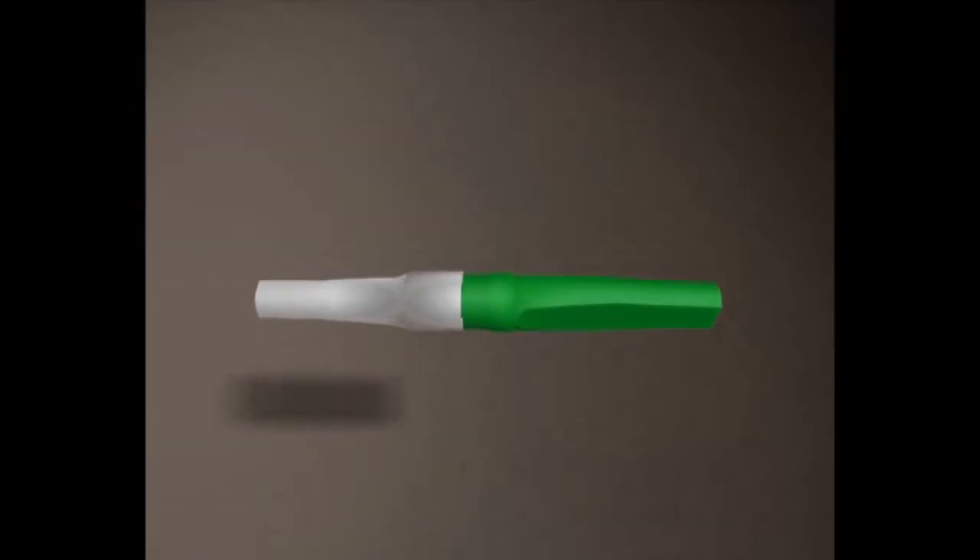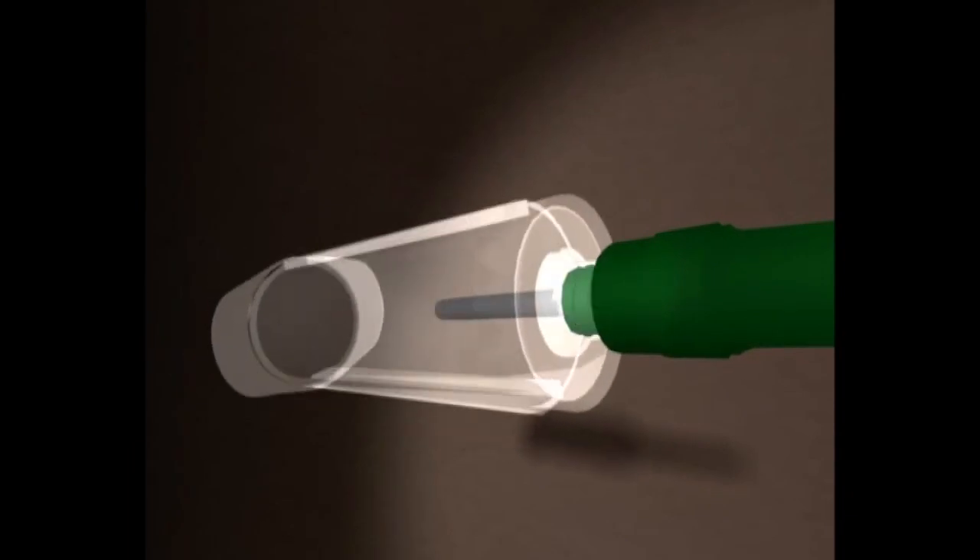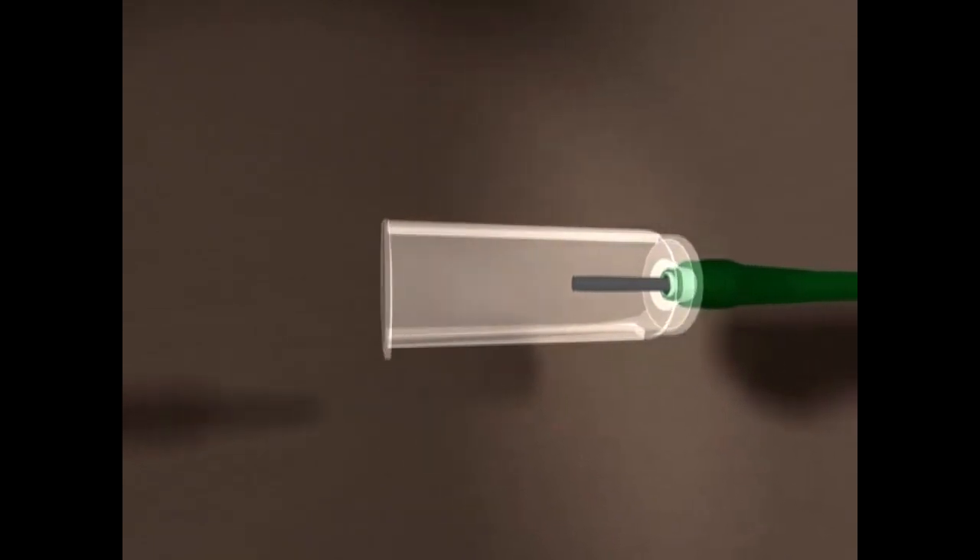To connect the needles to the barrel, twist the two parts in opposite directions and pull them apart. This will expose the screw thread and the rubber covered needle, which is then screwed onto the top of the barrel. The rubber covered needle will pierce the cap of the vacutainer tube when it is pushed into the barrel.